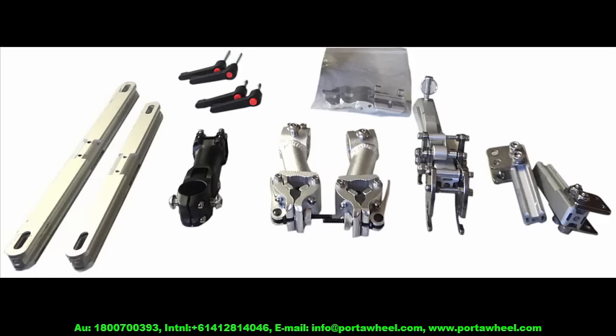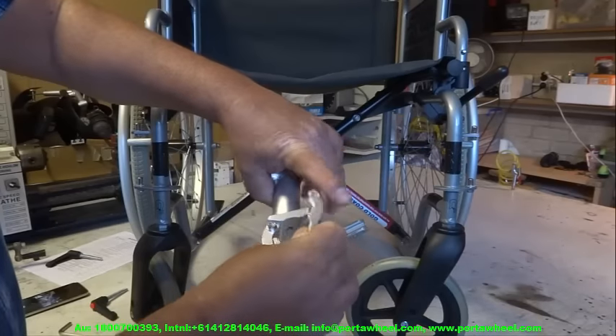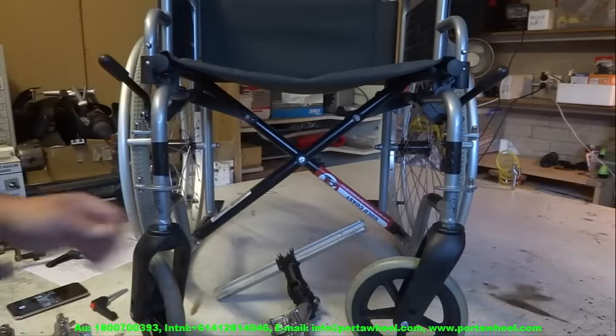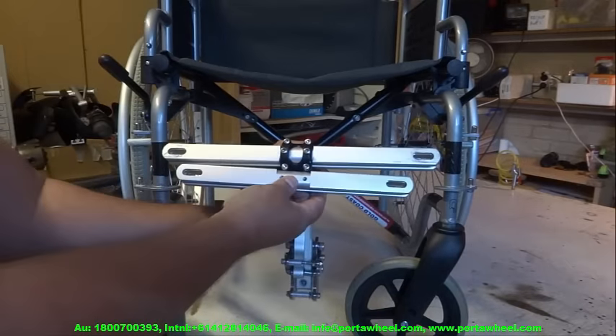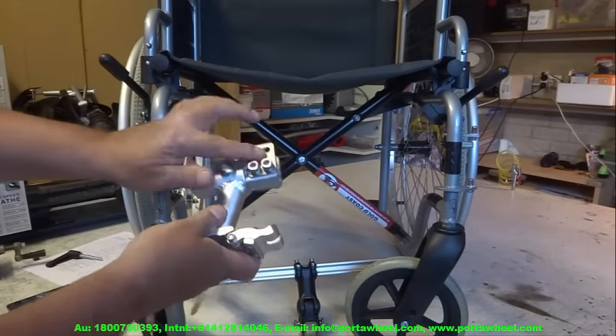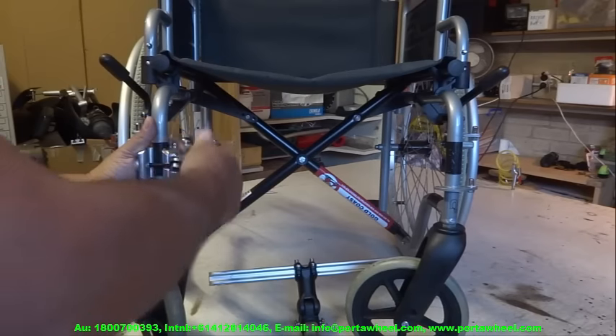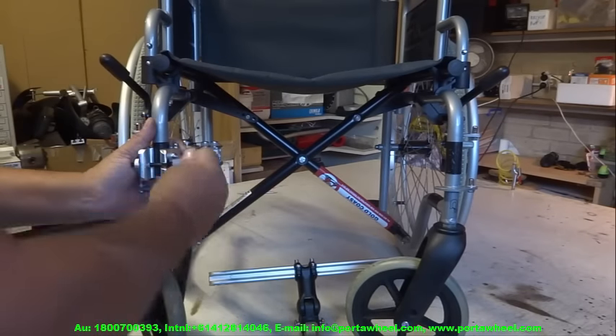That's it — you're done assembling the parts. Now we attach them to your wheelchair. Keep the grub screws finger tight as we'll need to make adjustments before tightening them with the included Allen wrench. Use the wide clamps without the spacer blocks for larger tubes, and the rubber liners for oval tubes. Then it's simply a matter of attaching the tube clamps to your wheelchair as shown in the video.